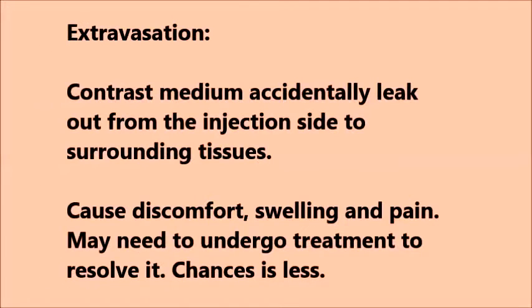If a contrast media accidentally leaks out from the injection site to the surrounding tissues, it will cause discomfort, swelling, and pain. This is called extravasation. You may need to undergo treatment to resolve it. The chances of having it is low.